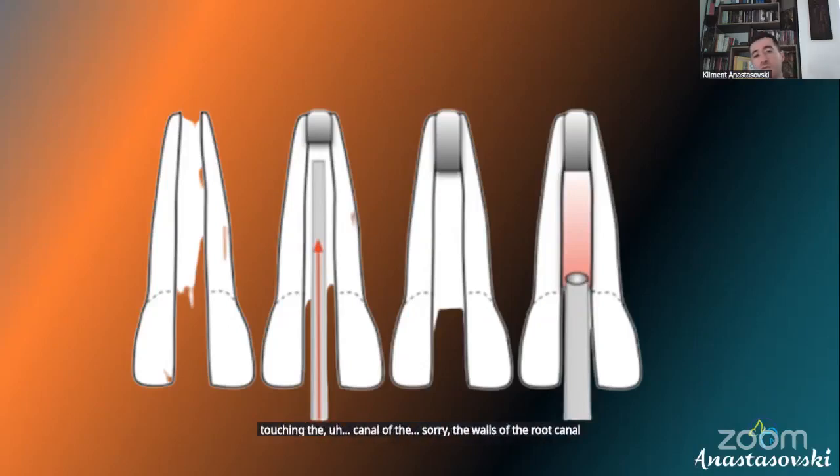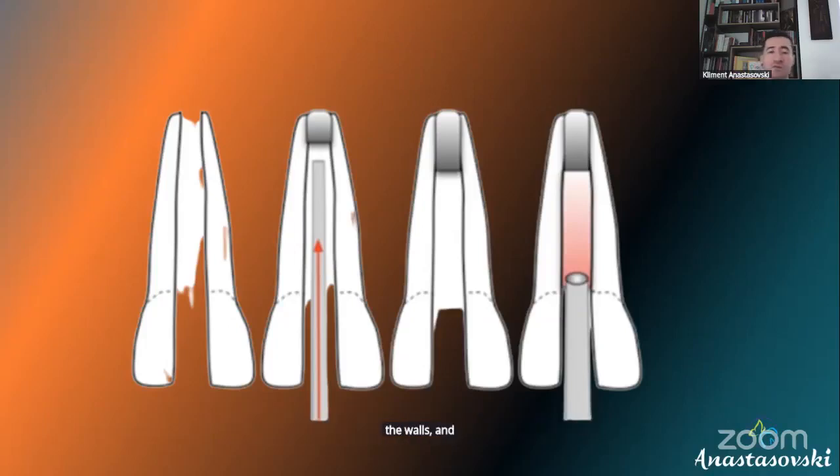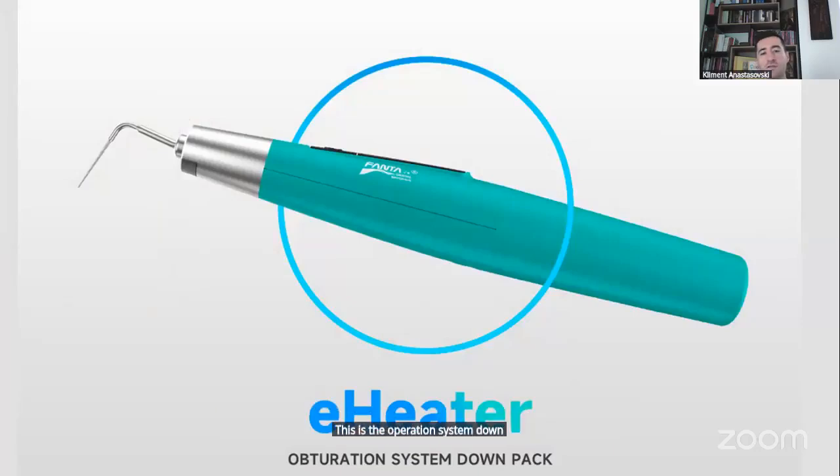This is the most important part, because later on you need to be pressuring or plugging the gutta-percha inside of the root canal, and you do not want the pluggers touching the walls and causing damage to them. So please choose your hand pluggers and tips carefully before starting the obturation phase, and you won't have any problems afterwards. This is the obturation system downpack from Fanta Dental Materials.